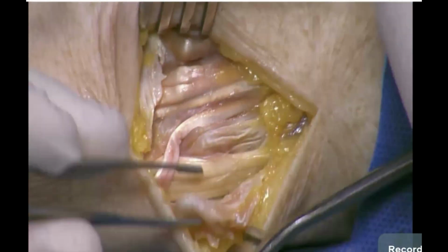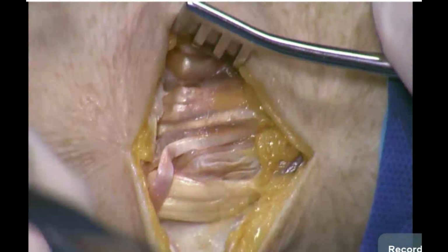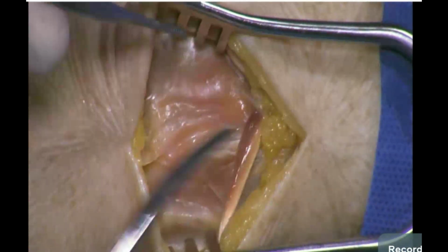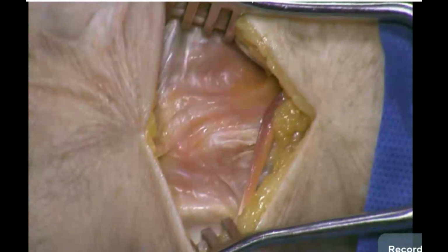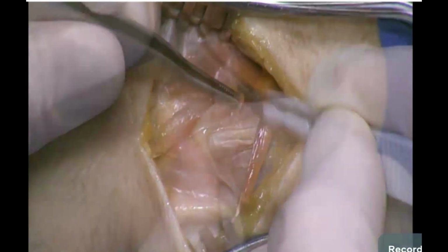And now we're exposed. So I have this large capsular retinacular flap that we'll use later in closure. I'm going to put this retractor between the third and fourth dorsal extensor compartments. Generally release a little more fascia there. At this point, I'll identify and excise just part of the posterior interosseous nerve.